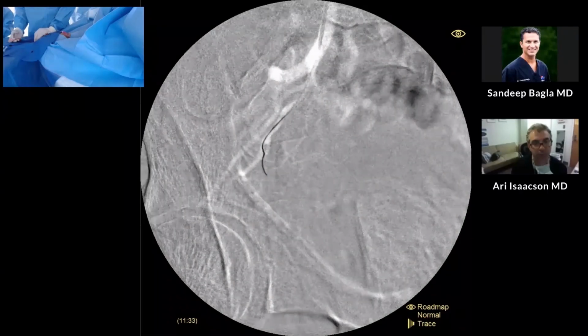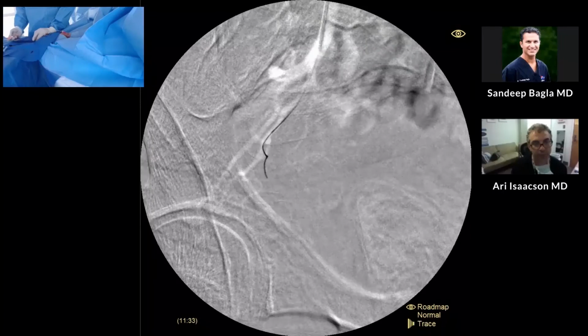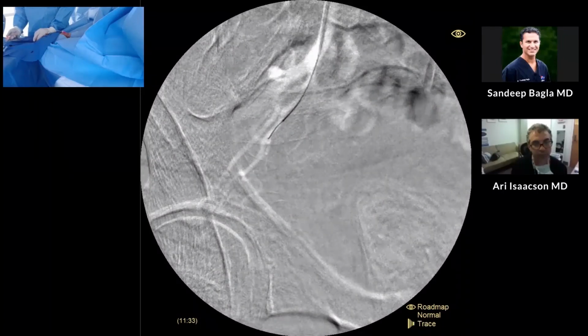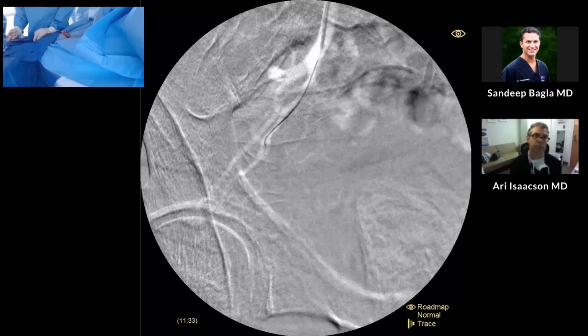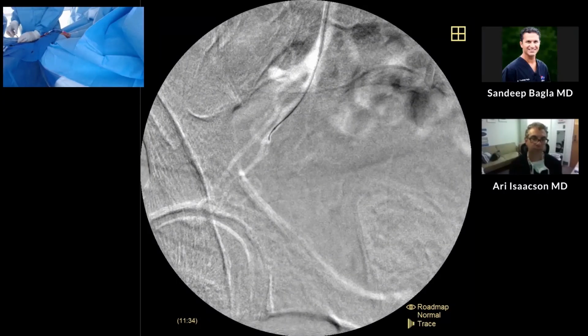But what I'm looking for here is, as I'm in this branch right here, I know the prostatic is right near the tip of this catheter. It could be just distal, just proximal. If we go back to the anatomy on the previous run here, you'll see this really well. It's a nice prostatic that you can see there just over the shadow of the external iliac artery.